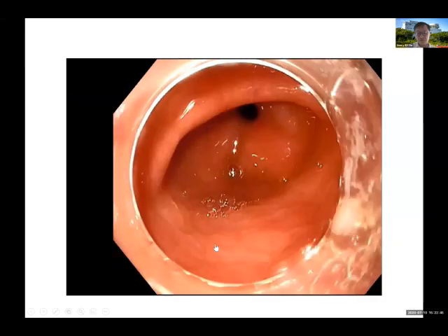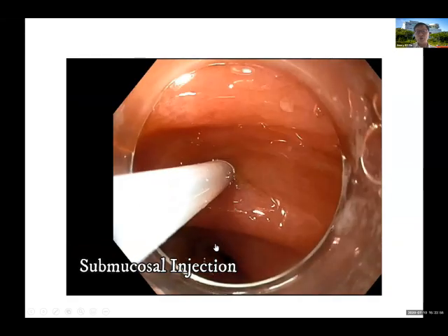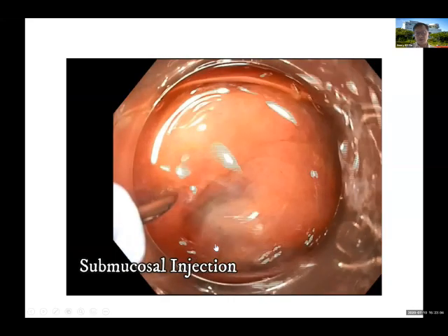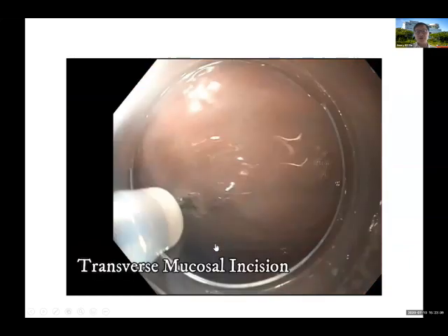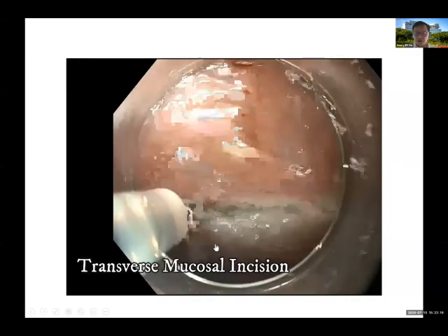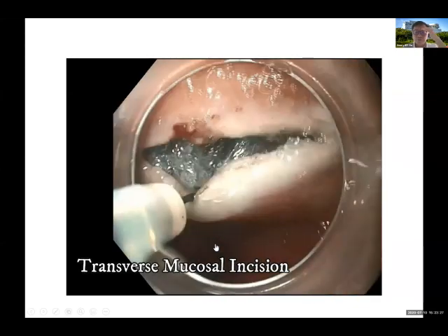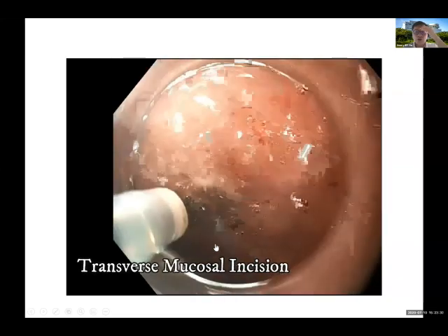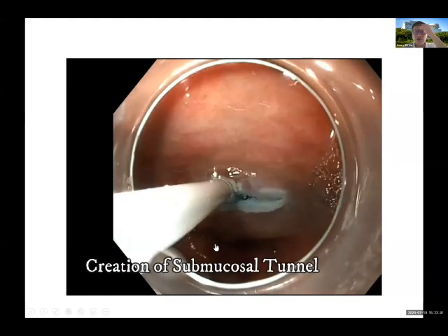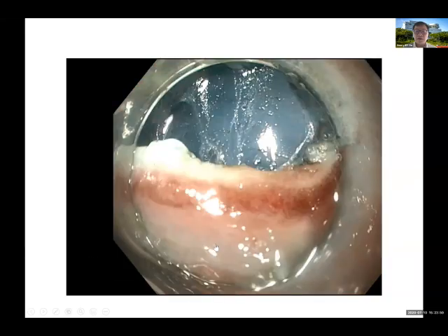In gastroparesis, we're using similar techniques to POEM, but the target is the pyloric muscle. First we enter the submucosal space about 2 centimeters near the pylorus, and we lift up the mucosa with saline injection. Then we make a horizontal incision. I'm sorry for the video, probably because of the transmission. I apologize for that. Basically, we make a transverse incision at the mucosa, just large enough for our endoscope, and then we enlarge the space with further saline injections. Then our endoscope can enter into the submucosal space.